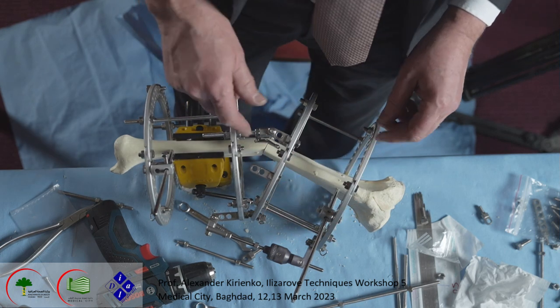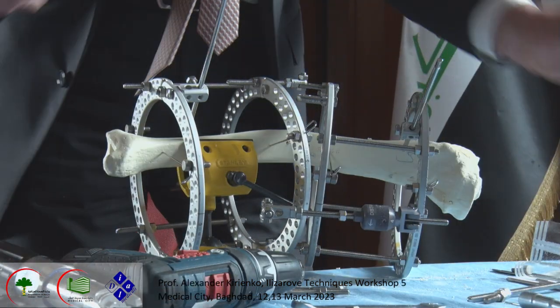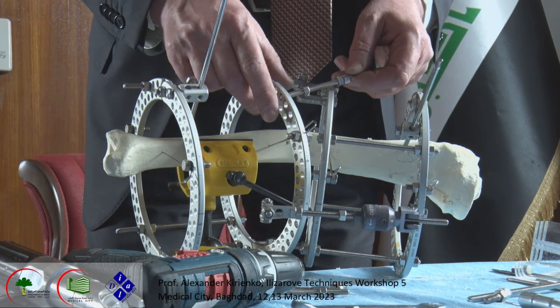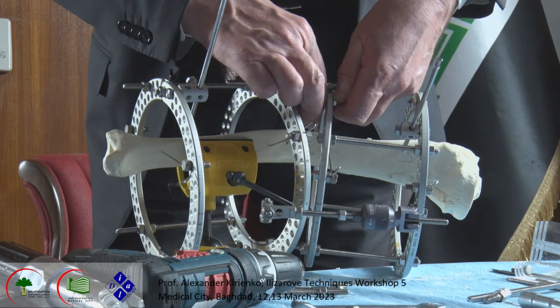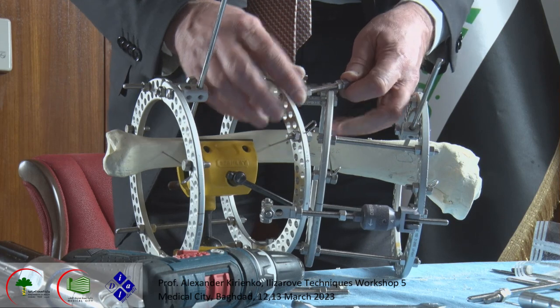Okay. If I mount in this system, for me it's really difficult to mount, because you see this is in the second hole. Now I should put this one the same in the second hole, but it's so near that I have a big difficulty to put inside.